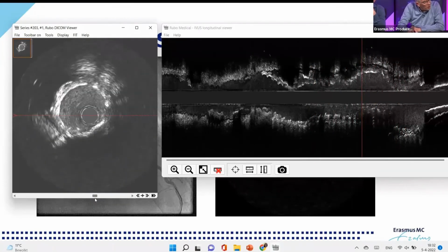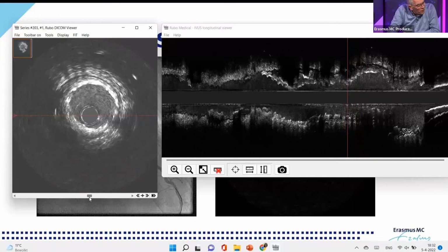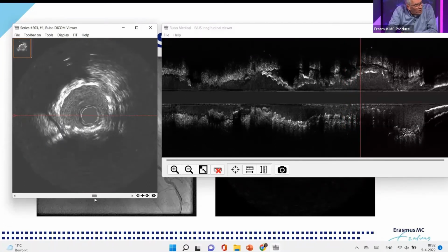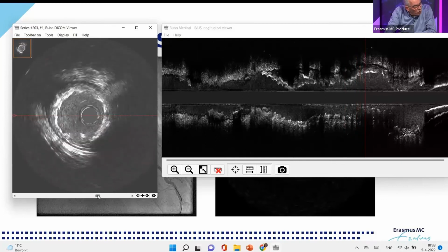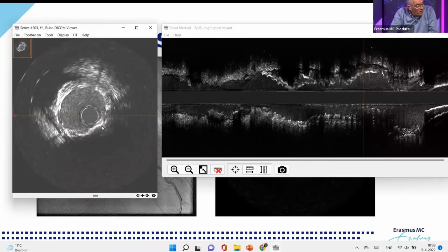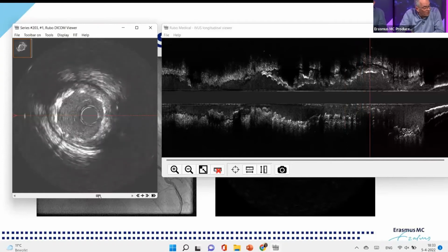If Karen and I are reporting, then we always look at the shape and why the shape is there. In this case, you see definitely a smaller stent area, and we see a chunk of calcium pushing against the stent. We see it sometimes more extreme. Then we call this under expansion due to calcium. That doesn't mean that we have a non-sufficient lumen, because that can go together.